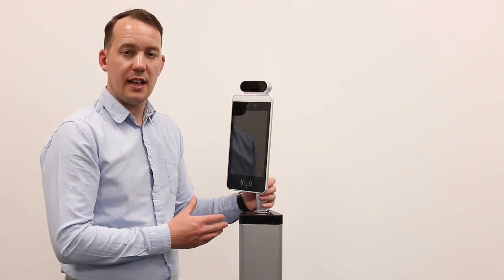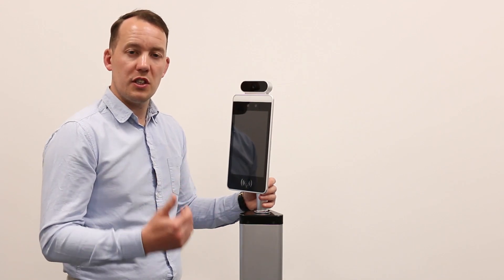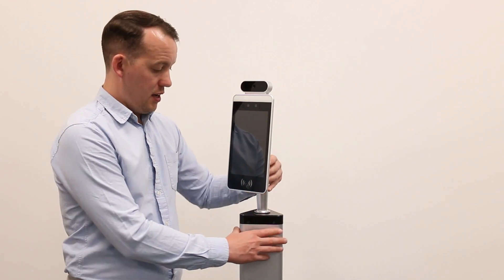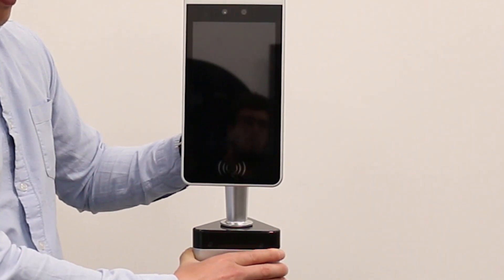The next step is to ensure that the device is central, facing the person who is going to have their temperature checked. We do so by turning the device at the rear of the device.